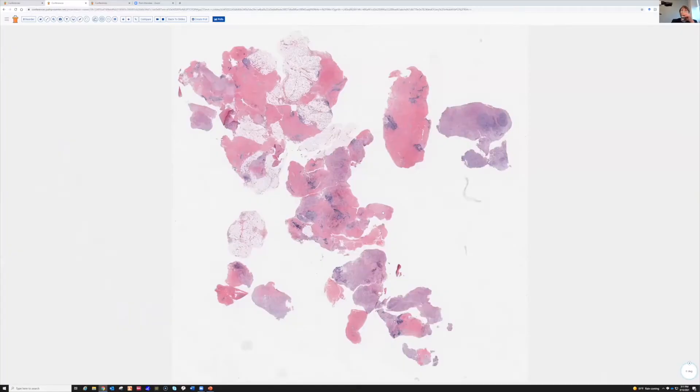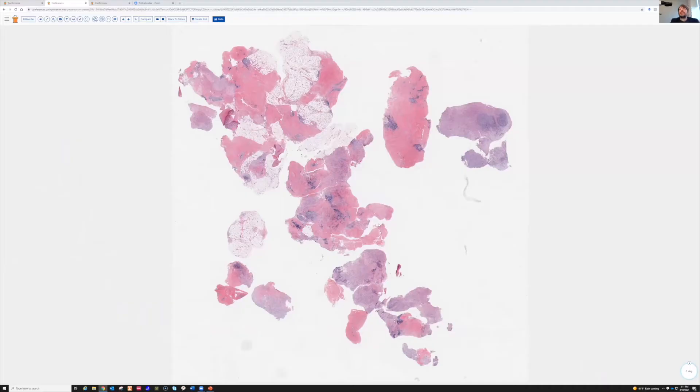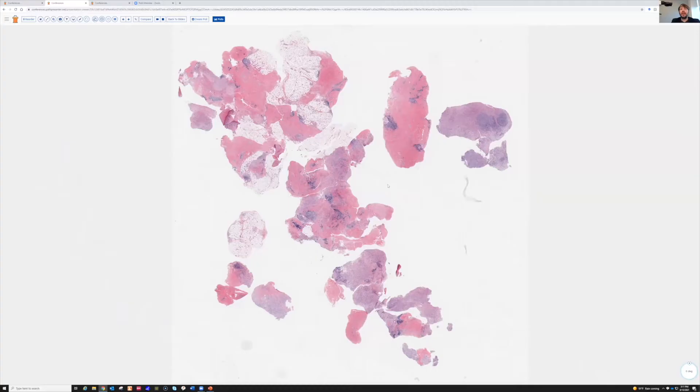Alright, now the next case. This was a mass from a hand of a middle-aged adult that was slowly growing and diffusely swelling the hand, so they went in and took a biopsy from it.